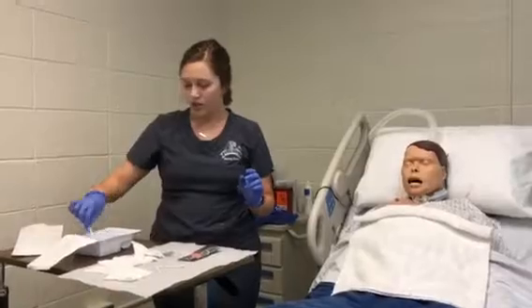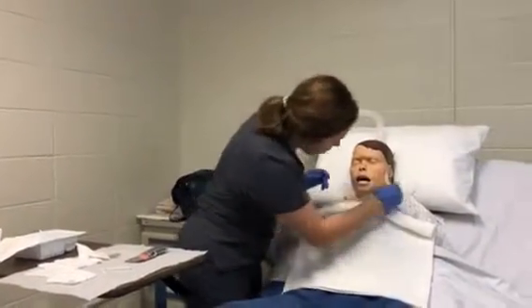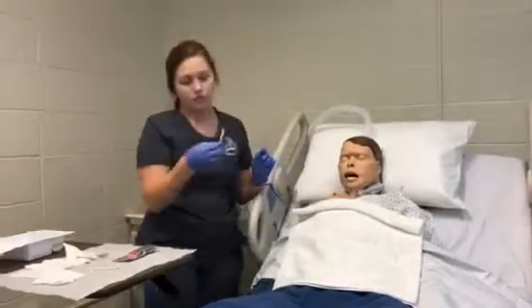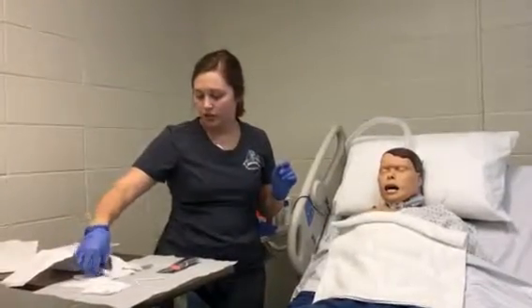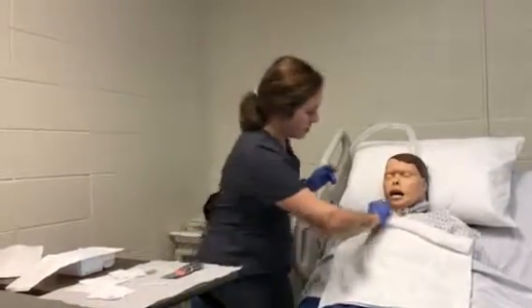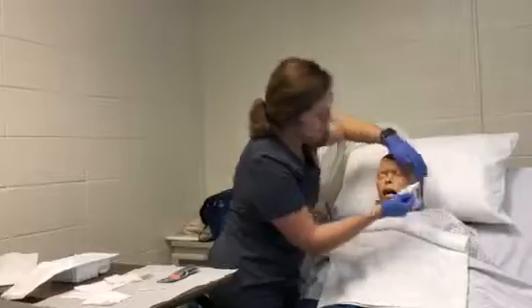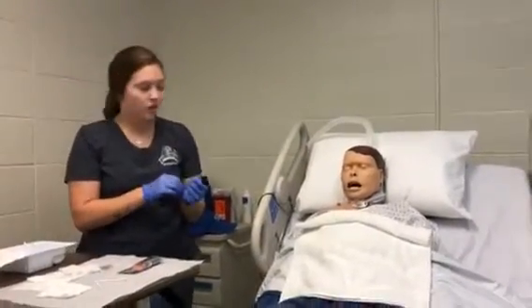We're just going to use the sterile water side, and you just clean under here really good. Okay, and those can go in the trash, and then you're going to use gauze to make sure that you clean under it really well, and make sure it's really dry, because the moisture can cause bacteria, and that's not good.